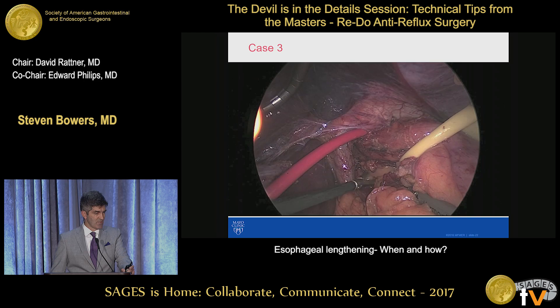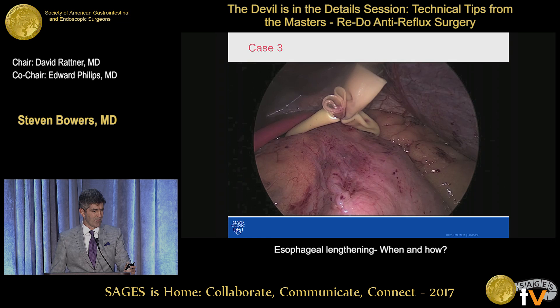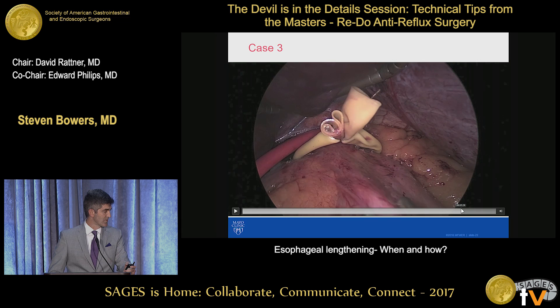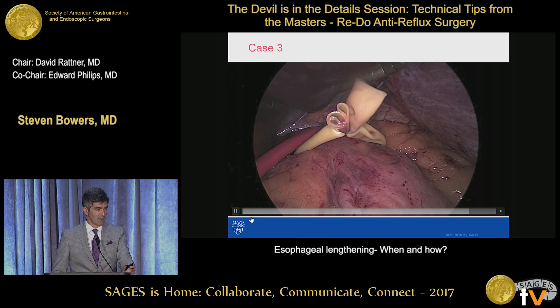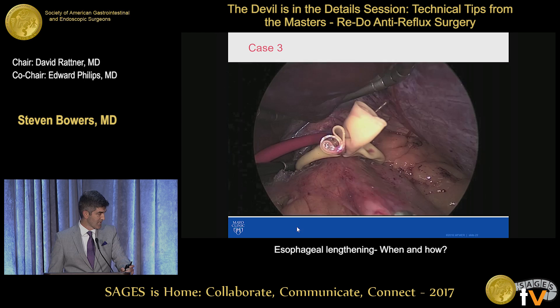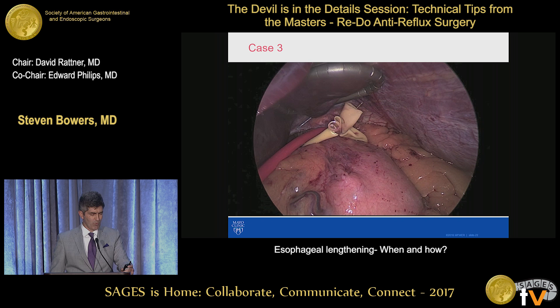I leave the hiatus open to allow the bougie the easiest passage down. When I have the anesthesiologist place the bougie, I always put the stomach on traction. So my anesthesiologist told me during this case that the bougie doesn't quite feel right — and he told me that at 40 centimeters. So I said, back it up. The bougie kind of jumped back, and that is never, ever good. So then I did a diagnostic laryngoscopy and did an upper endoscopy, and it had perforated the piriform sinus and then perforated back into the esophageal submucosa.